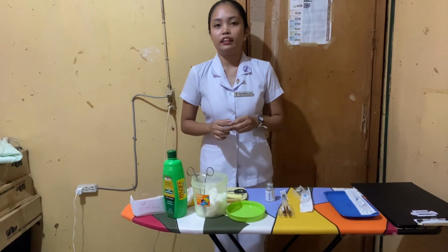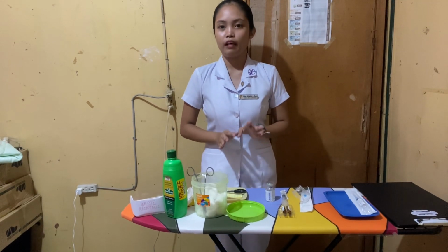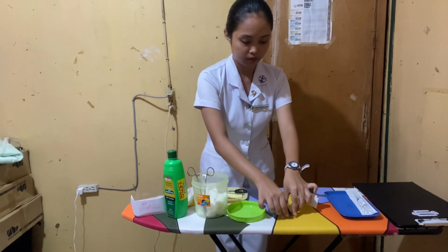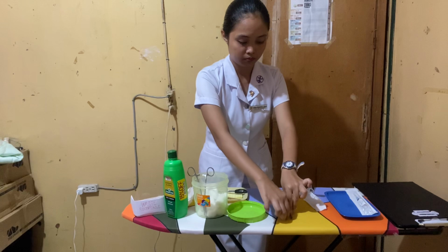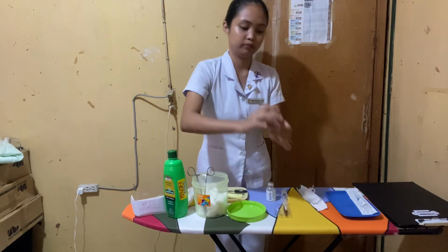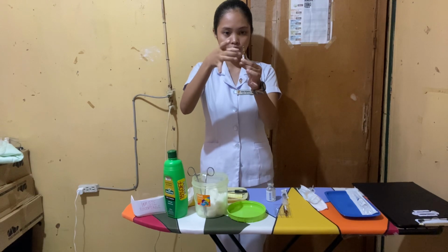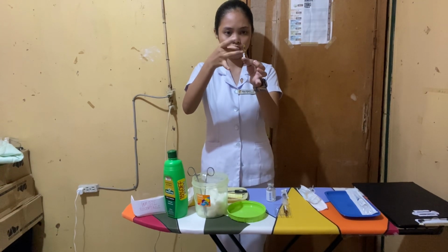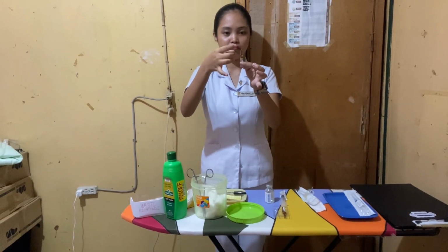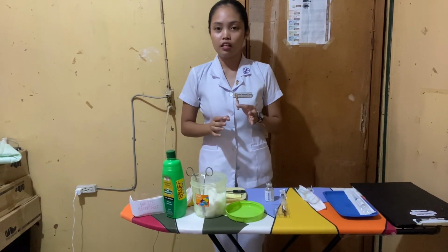Okay, I'm going to set it down first. So with an ampule, what we want to do is flick the upper stem of the ampule a couple of times first. After doing that, we're going to get gauze or cotton balls.